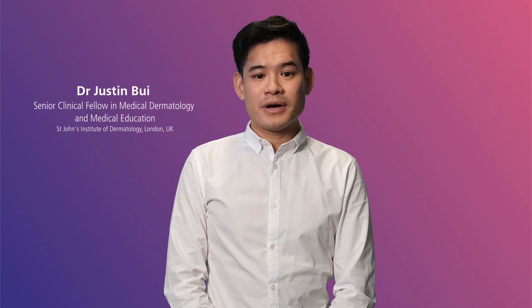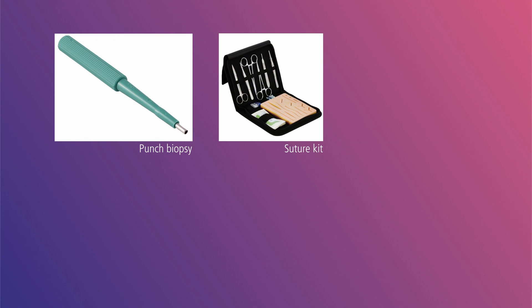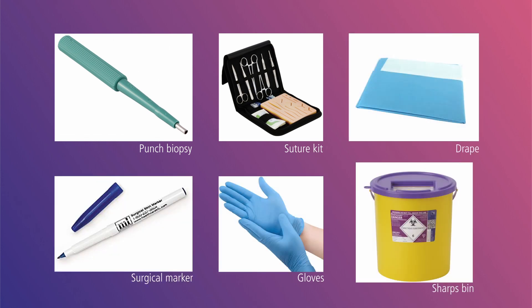Hello and welcome to the punch biopsy procedure video. For this procedure you will need a punch biopsy, a suture kit, a drape, a surgical marker, gloves, and a sharps bin.